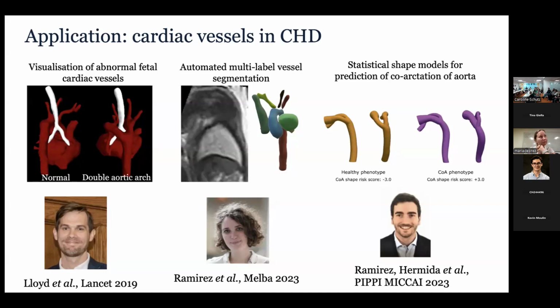Do you use a specific sequence for cardiac, or is it through HASTE? It's HASTE, but they like to reduce the echo time to 80. For brain, we used to have 120, and now they even moved to 180 because there is lots of signal. But for cardiac, they prefer to go lower echo time. Otherwise, it's exactly the same. And we are also now using the deformable for it. You can do it with rigid because it's still within the rib cage, so it works okay with rigid. It works just a teensy bit better with deformable.